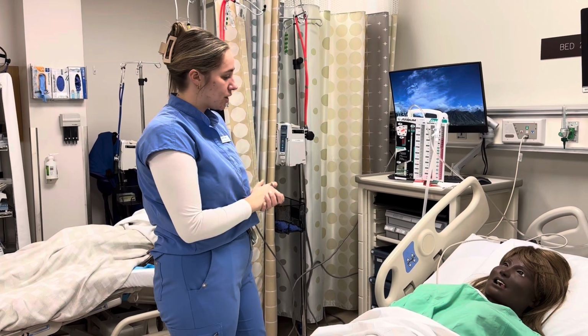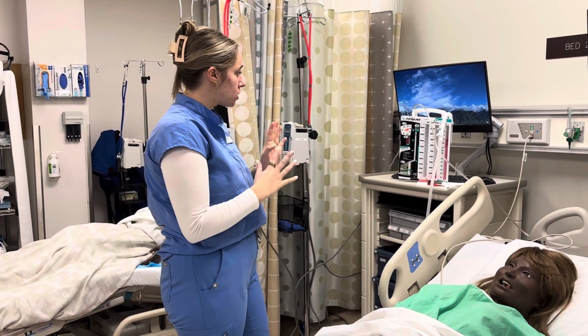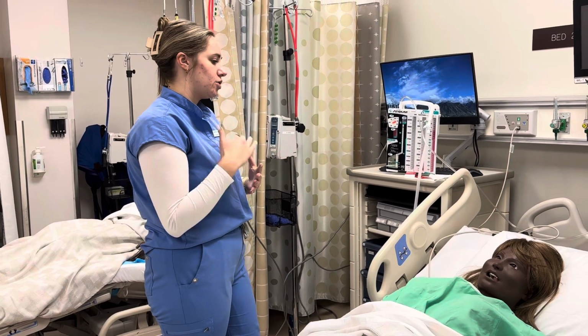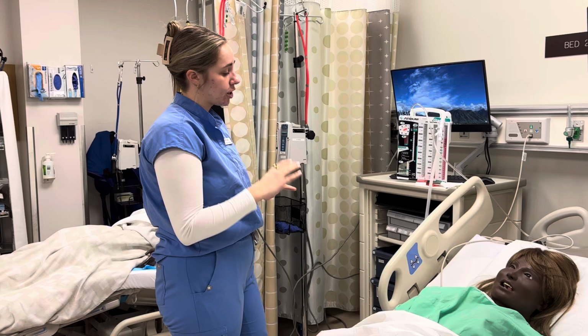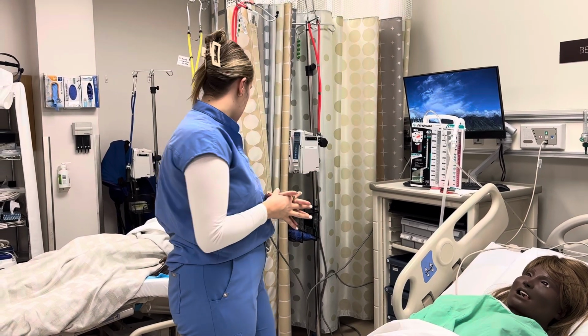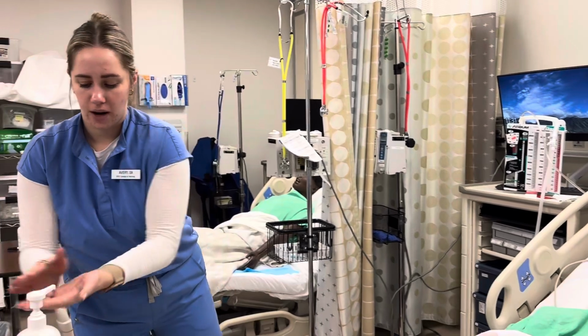Okay, Alphabet, today we are going to be going through and just looking at your chest tube. I'm just going to be checking to make sure that the bandage looks good, that the tubing's looking good, and that the machine's working properly. Before I do that, I'm going to do a little workup, check your vital signs, check your pain score, things like that, and explain to you what's going on. So first, I'm just going to put on a pair of gloves.